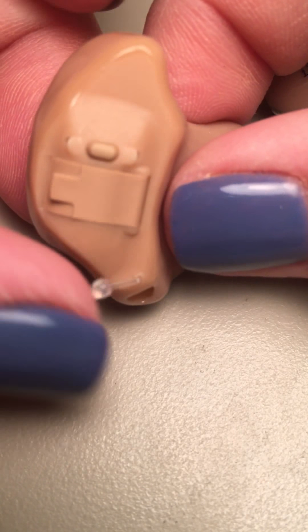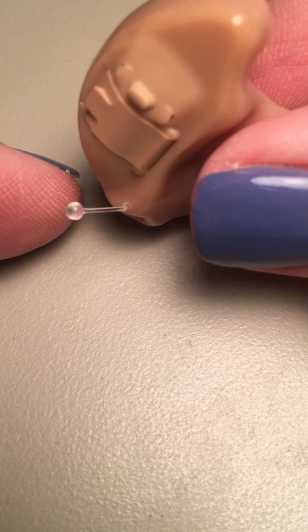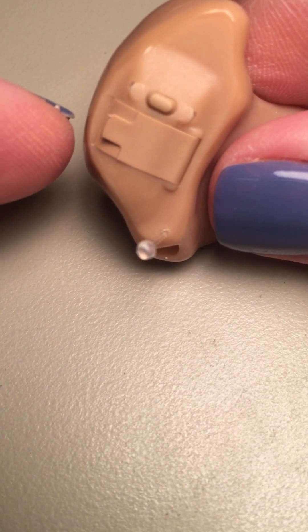If you look at the outside of the hearing aid, this is the part that people see from the outside of the ear. You've got a couple of different things here. You've got a little pull string right there — it looks like a little antenna, but it's not. That's just a fish line with a ball on the end of it.